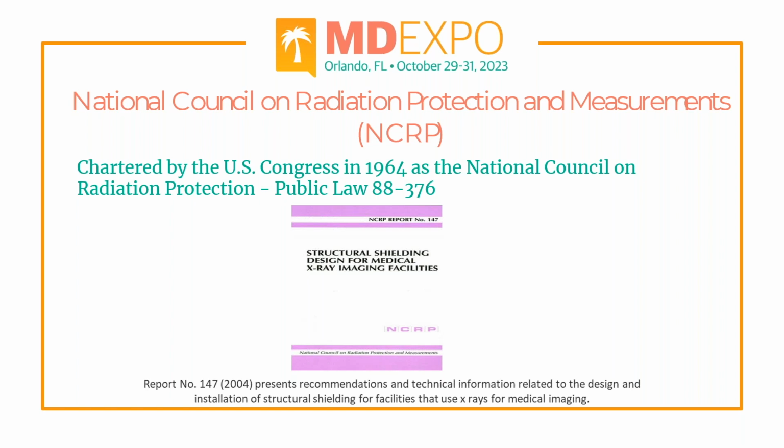All right. So if you're involved with, for example, X-rays, setting up or designing X-ray rooms, there's an organization called the NCRP, which is the National Council on Radiation Protection. They publish these reports. It was chartered by Congress in '64. Basically they have something for the shielding. If you install an X-ray room, you need to set up the shielding, and those shielding requirements are established in report number 147.